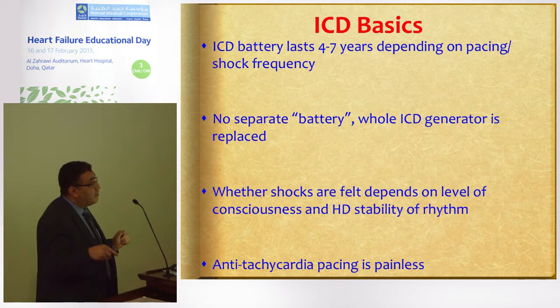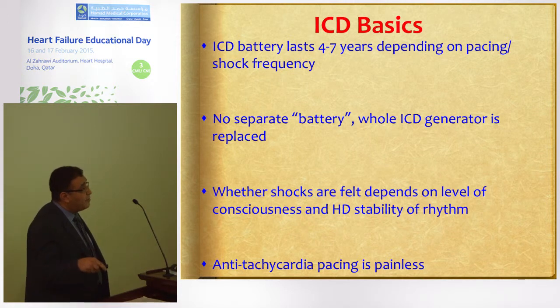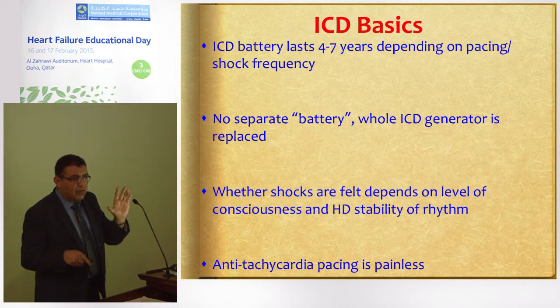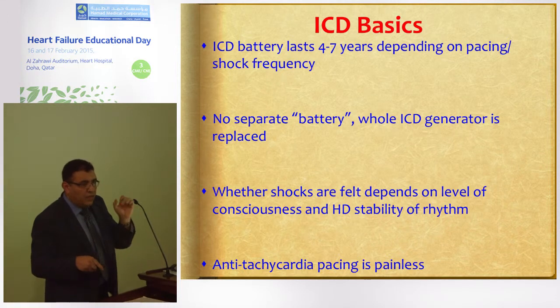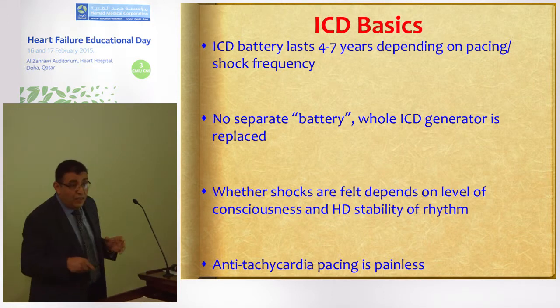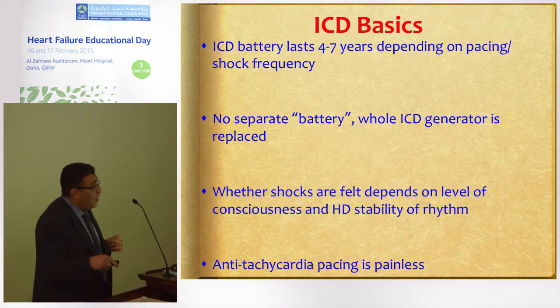Whether shocks are felt depends on the level of consciousness and the hemodynamic stability during that rhythm. If the patient sustains ventricular arrhythmias, loses consciousness, and then the device gives the shock, he will most likely not feel it. But if it's before that, then he will feel the shock, and it is quite painful.